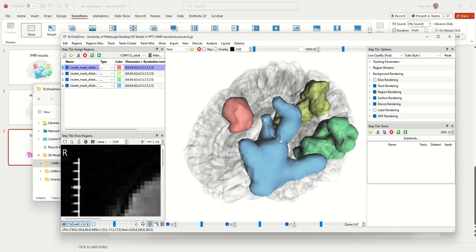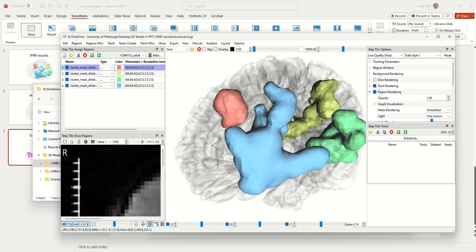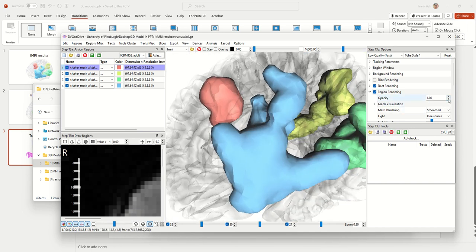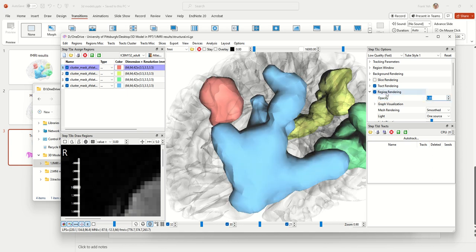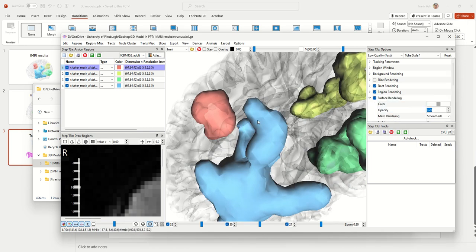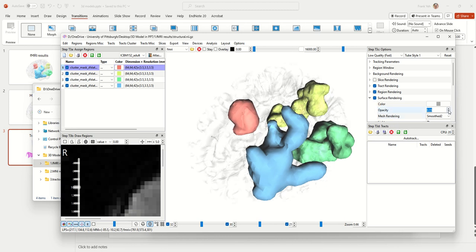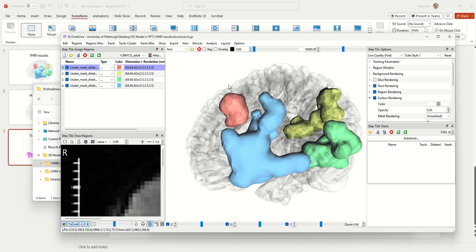One thing to note before exporting the 3D model to PowerPoint: the region is a little bit transparent, which may not look good when inserted into PowerPoint slides. I always increase the opacity of the region rendering to one so it becomes totally opaque and not transparent. Of course, if you prefer a different setting, you can change the rendering settings here. Region rendering controls how those regions render in 3D, and the ISO surface opacity and color can also be modified.